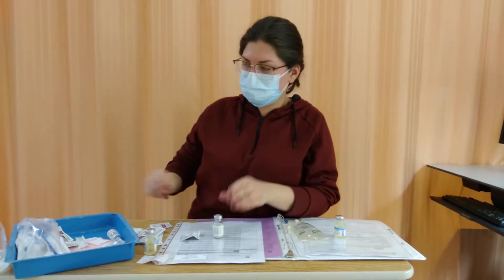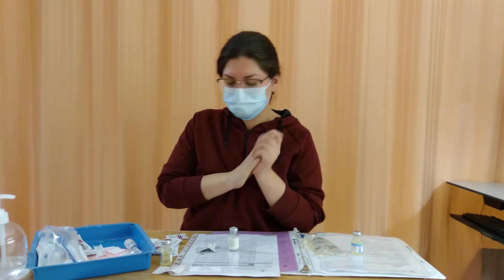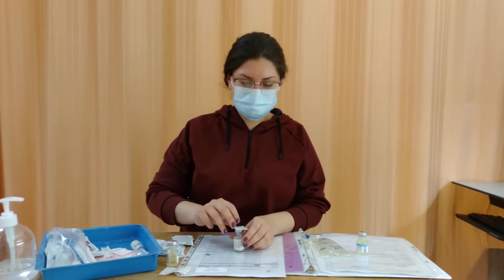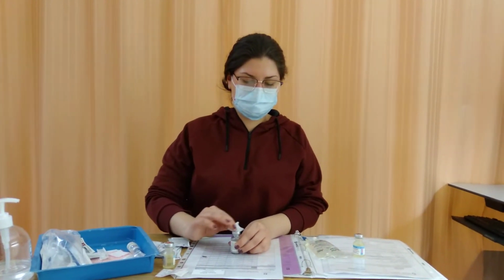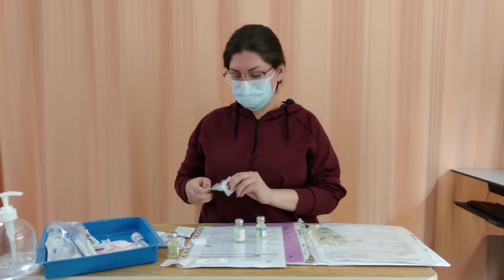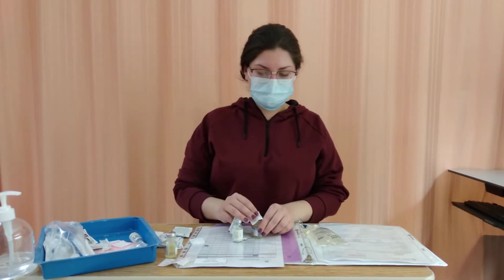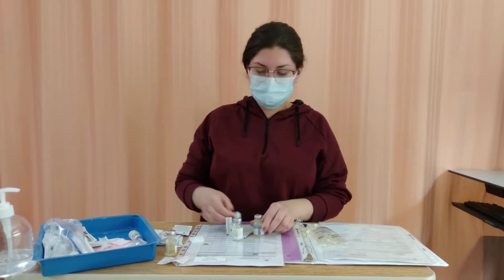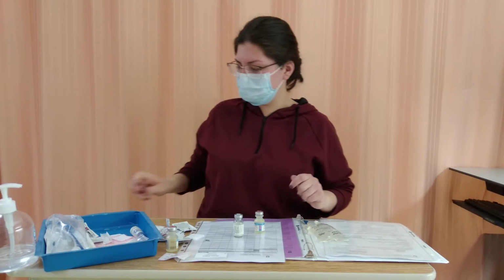Make sure it is half full. Okay, so just to do some hand hygiene. After that, I'll make sure I label my line, secondary line. Then I can set my rate. Okay, so that's for 30 seconds. Let it dry for 15. Then total volume is 100.